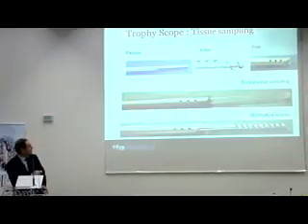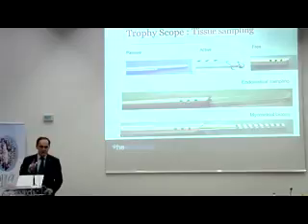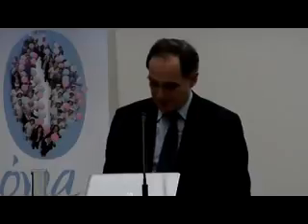So, passive situation, you have the smallest possible hysteroscope, and we know that size matters in hysteroscopy. In hysteroscopy, size matters. It is absolutely a difference, a 5 or a 2.9 millimeter instrument. It's the difference between killing a woman and having a friend for life. You put it forward, you get a progressive atraumatic dilatation, double flow, and you take it out. You can put a D&C cannula, and you could put a new instrument which is called the spiratome for myometrial biopsies.